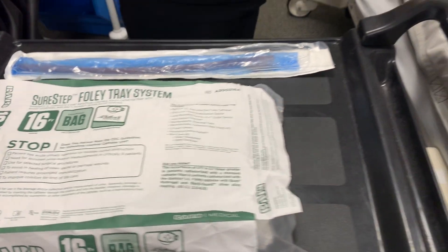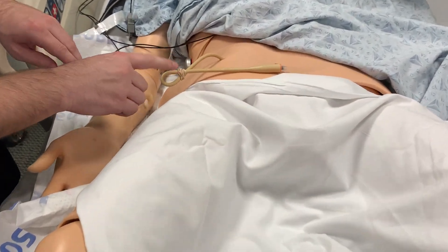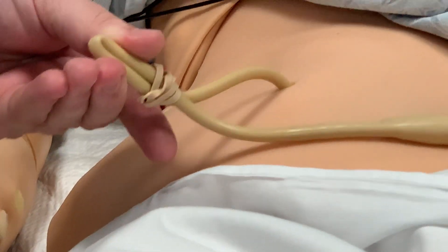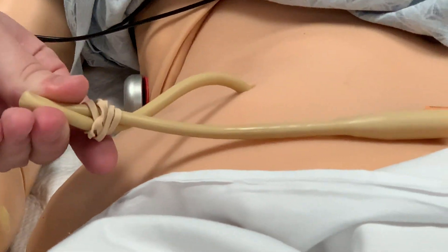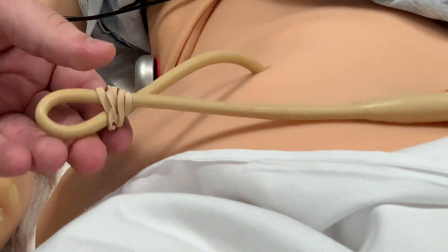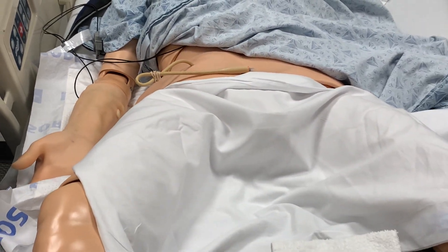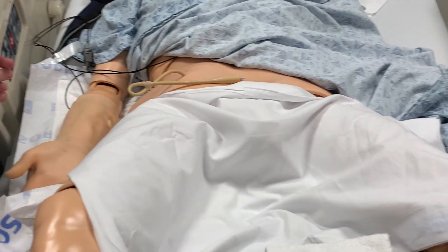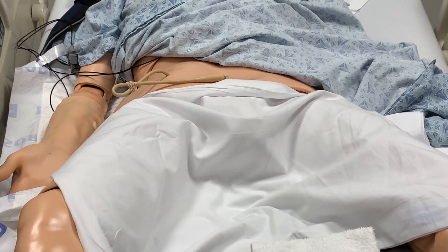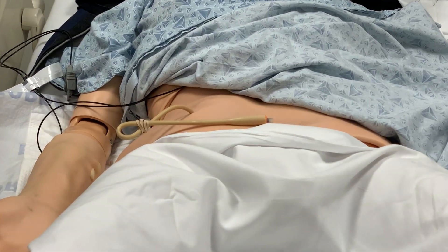To start, we'll have to remove the existing suprapubic tube. The first thing you want to do is clamp the tube. You can clamp it with an alligator clip — in this case we're using a rubber band — whatever you have that can clamp the catheter without breaking the tubing itself. We want to leave it clamped for about 30 minutes. That's to allow urine to fill the bladder, so that when we insert the new suprapubic tube, we get urine return and we're sure that it's in the right spot.